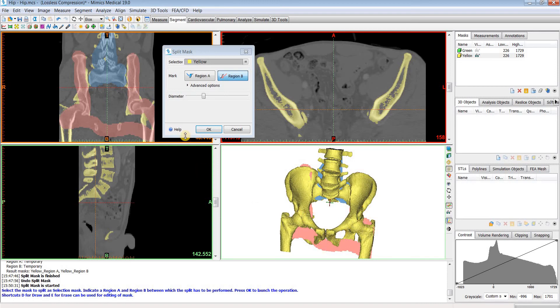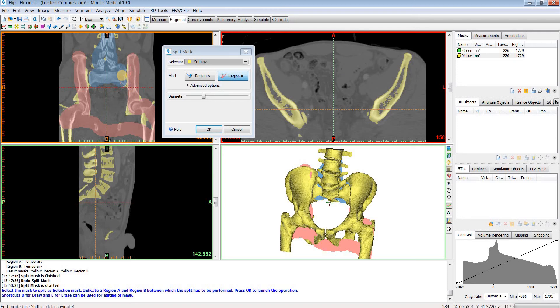It also usually helps if you mark the areas where they're connected or really close to each other — the tool will have a much better outcome typically. So I'm going to hit OK.